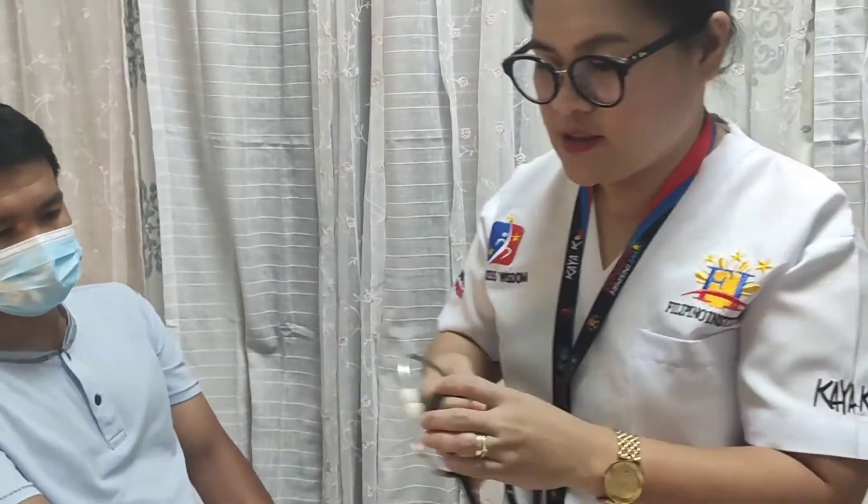To check the blood sugar level: it depends on the indication of the doctor. If the patient is diabetic, you need to check the blood sugar level; if not diabetic, it depends on the doctor's order. Check the expiry date of the strips — note how many days from opening the strips are valid, which should be 180 days upon opening.